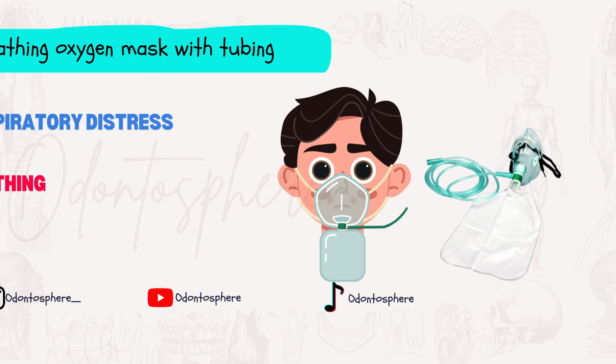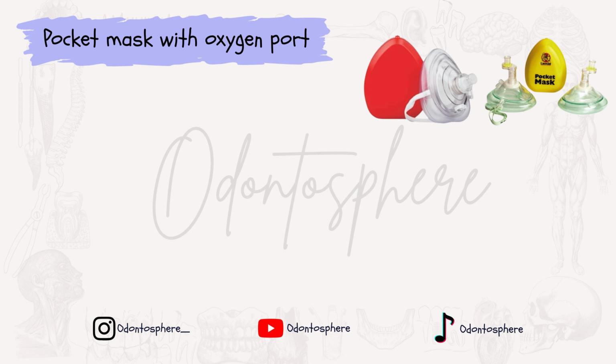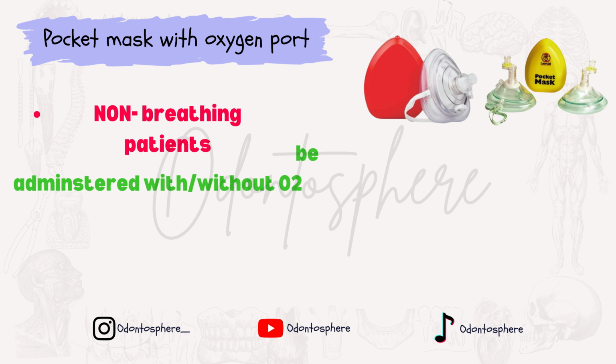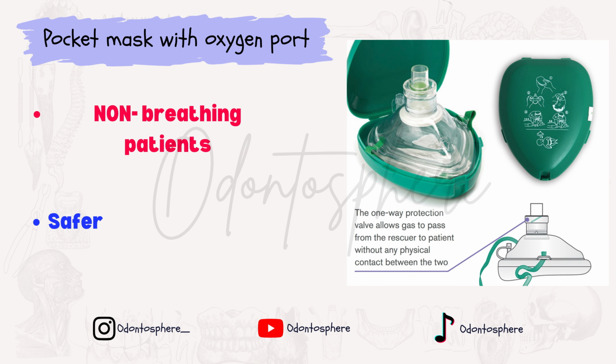Then you've got the pocket mask with the oxygen port. This one, on the other hand, is used to ventilate non-breathing patients. The main point or the advantage of using this mask is that it allows rescue breaths to be delivered with or without oxygen. The oxygen port on that mask, as you can see, enables the supplementary oxygen. And this mask is usually safer for the operator or the healthcare provider in this instance.